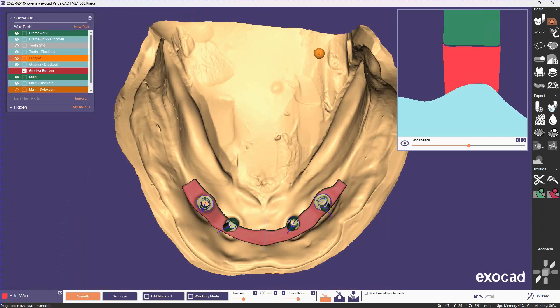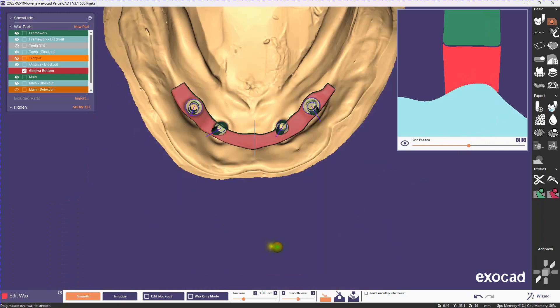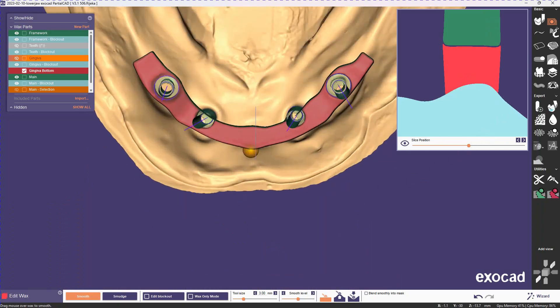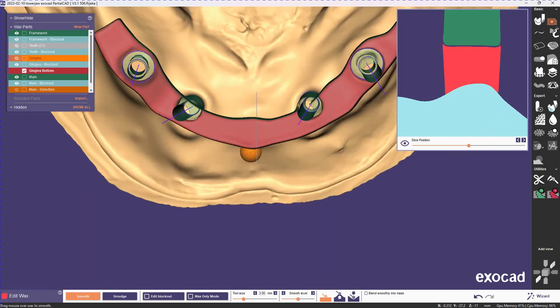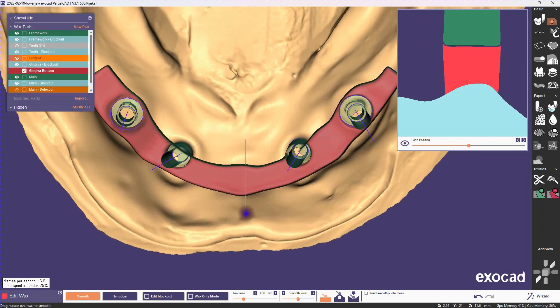So what we'll do now is we'll just apply an additive smooth to the whole top of the bottom gingiva. It'll take care of that edge, and we'll also fill in the gap.